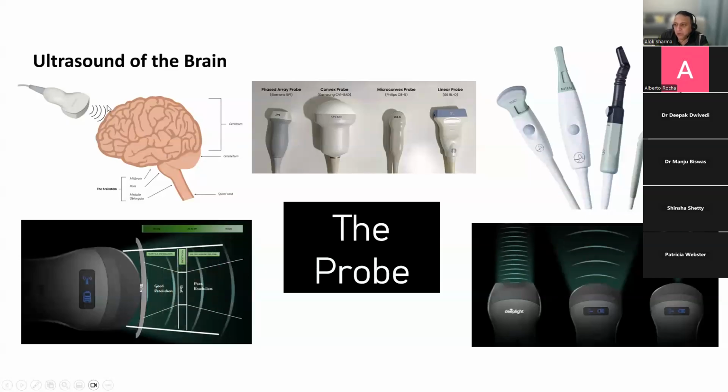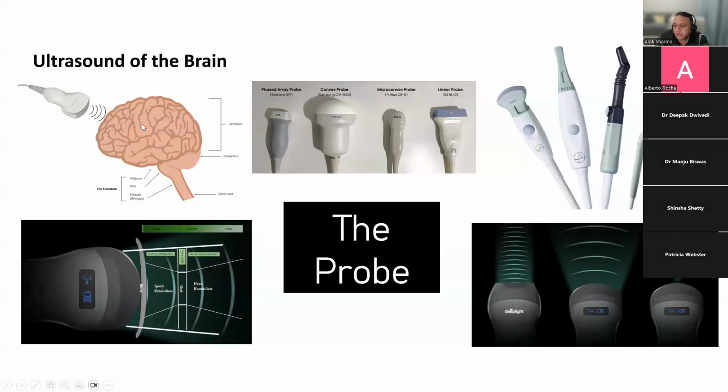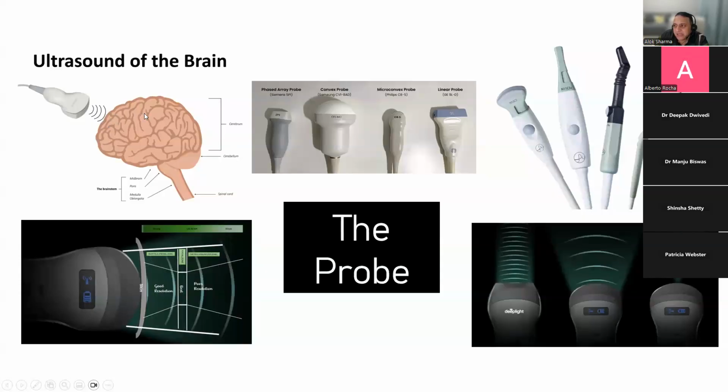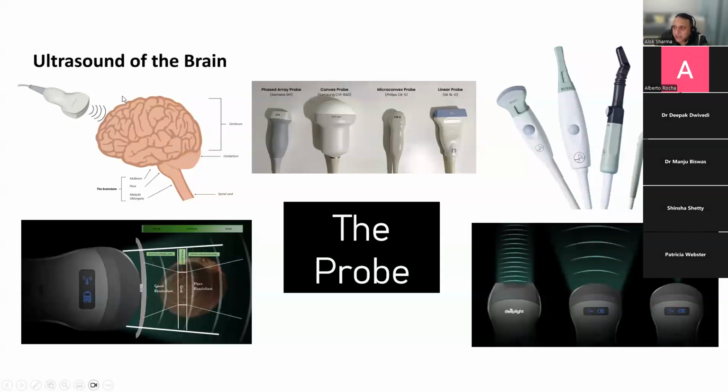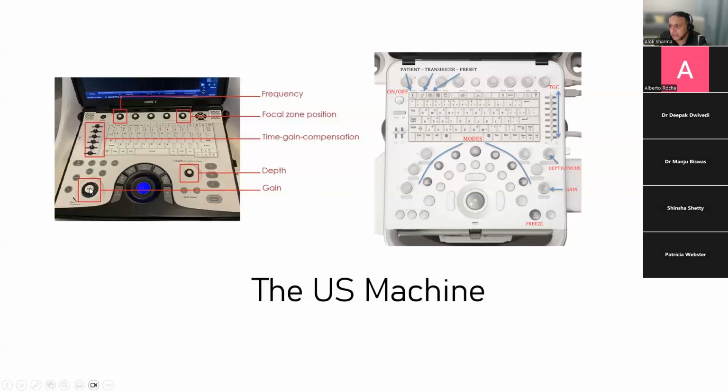But naturally, when you use that preset for a baby who's 38 weeks versus a baby who's 32 weeks, the same preset for a near term and a term baby, you'll still have differences in size of the brain, and you'll still have differences in the baby's echo texture because of the way the brain is, the water content, all of those things, the reflectivity. So that one setting will not suffice for all. The two ways that you're going to change it is you either press auto twice, and that will give you the optimized gain setting if that is the way your machine is set up.